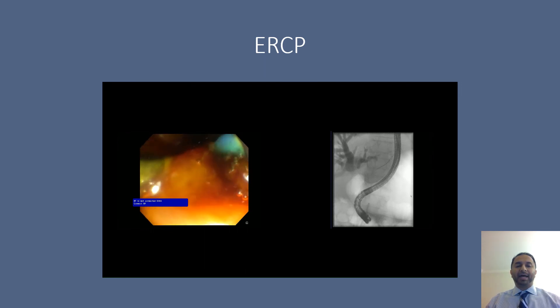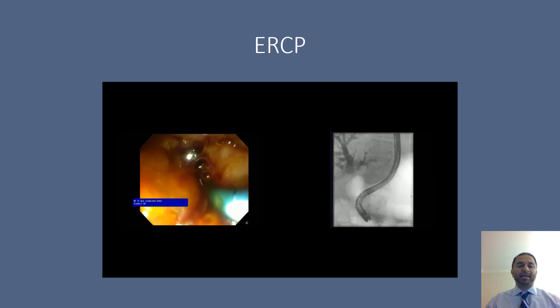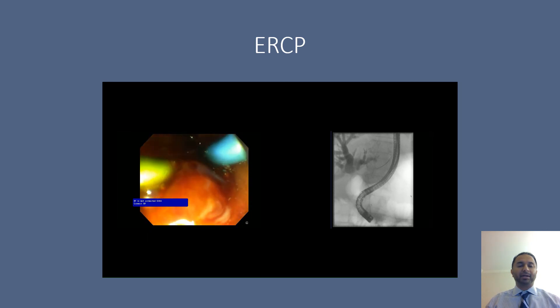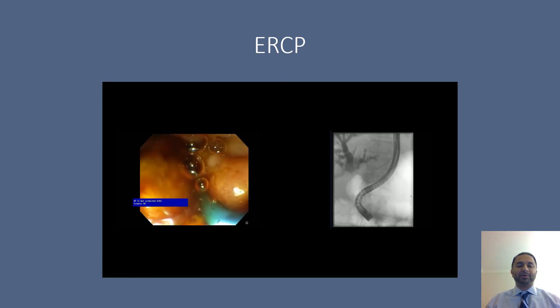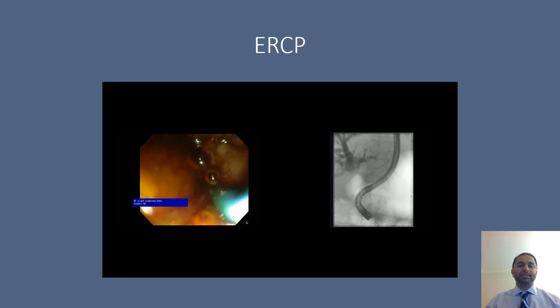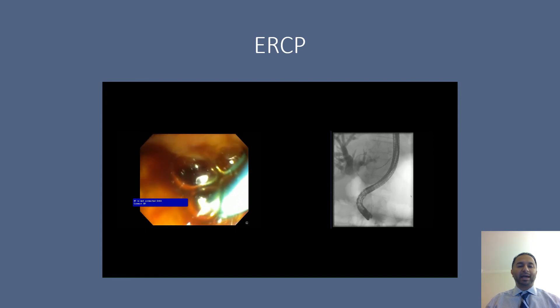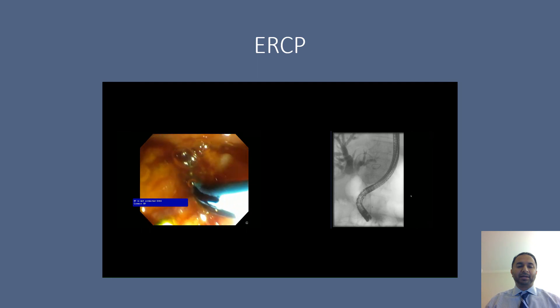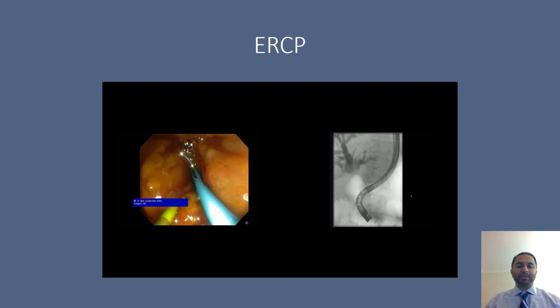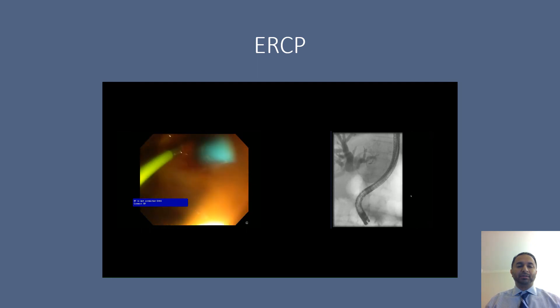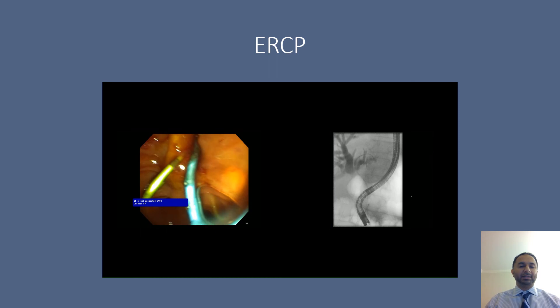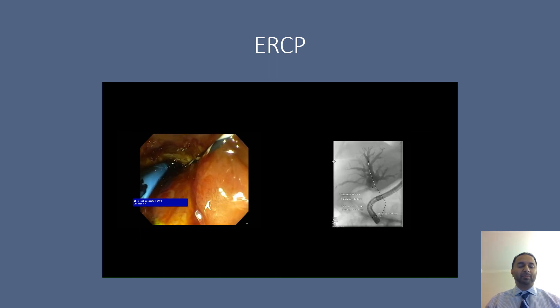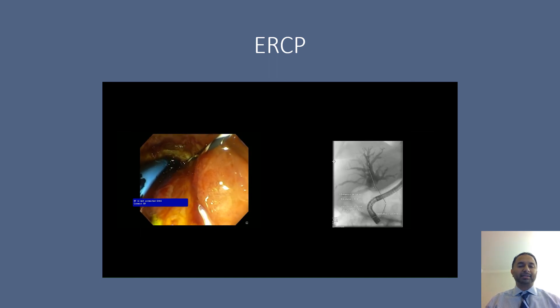After that is done, we're able to place a plastic double pigtail stent into the left hepatic duct, since this was the more difficult segment of the bile duct to attain access. This stent is then deployed into the lumen. The other stent that you see in the image is actually a pancreatic duct stent that was placed prior to accessing the bile duct.